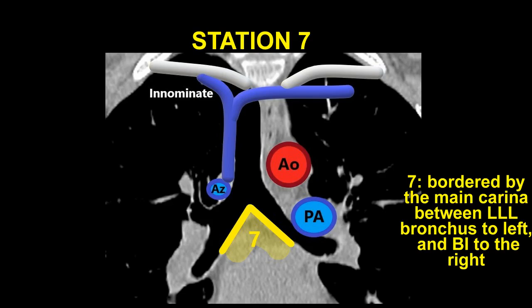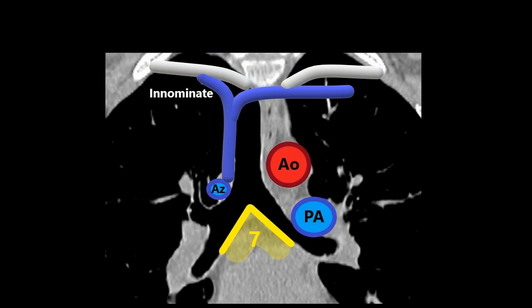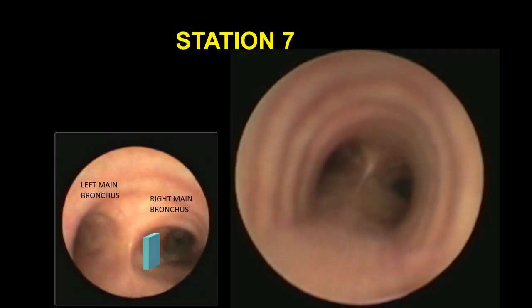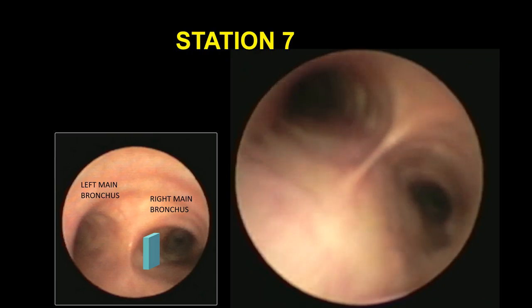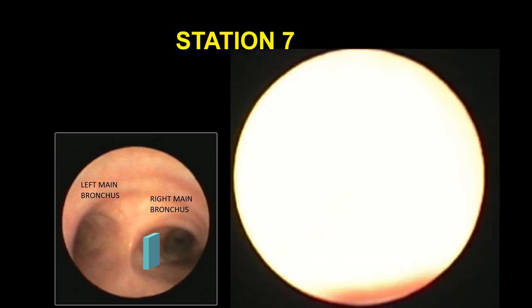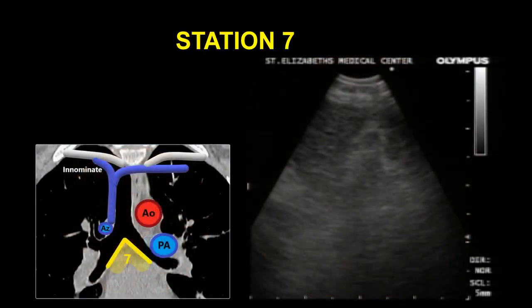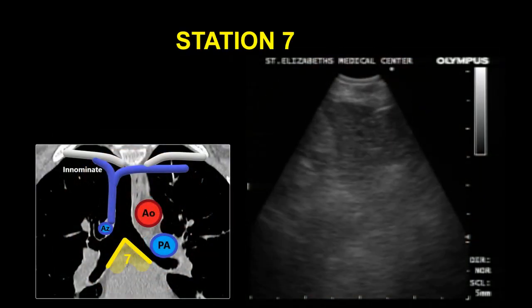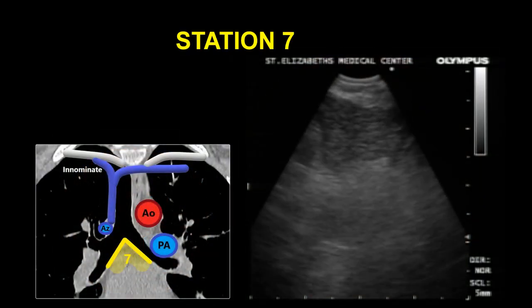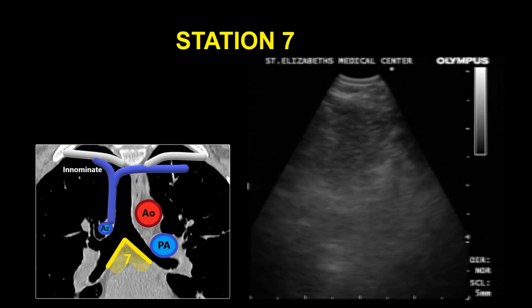Station 7, the subcarinal nodal station, is bordered by the carina of the trachea to the upper border of the lower lobe bronchus on the left and the lower border of the bronchus intermedius on the right. Station 7 can be visualized by placing the scope in the proximal right or left main stem bronchus with the probe facing medially. In this video, the scope is in the right main stem bronchus and the lymph node can be seen above the left atrium.